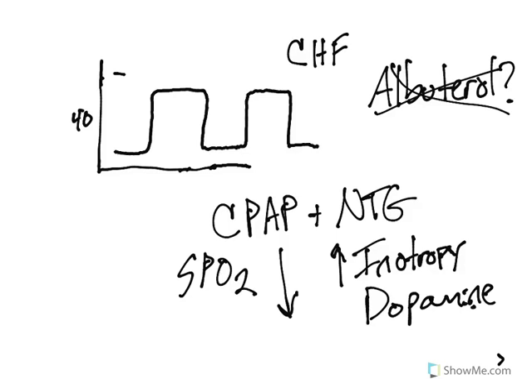But that problem of increased myocardial oxygen demand is offset by this increased inotropy, okay? Because I'm getting a more efficient squeeze out of the heart, I'm actually offsetting any of the problems that I may find with increasing the heart rate. So that increase in heart rate will again be offset by that increase in inotropy. All right, so let's look at a couple of other types of end-tidal CO2.